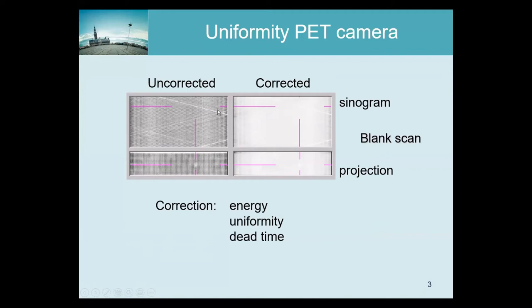Very little errors like this, especially because it's a cold one. So in this case, white means low photons. You can live with that. You can scan it and still get quantitative images. But if an entire block would be out, you will get a big white line here, then you should replace it urgently. So if you see something like this, and in the end we decide that that thing should be replaced, we just wait till the next maintenance and then have it replaced.